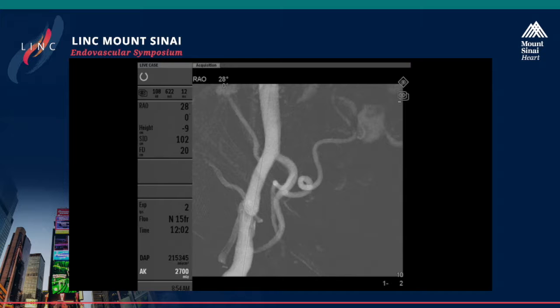So actually you should use 2 filters, or what do you think on this? Well, PK, would that be technically feasible in your eyes, to have 2 filters? I think with directional atherectomy, I think all of you would agree that it's very difficult to have 2 filters down.